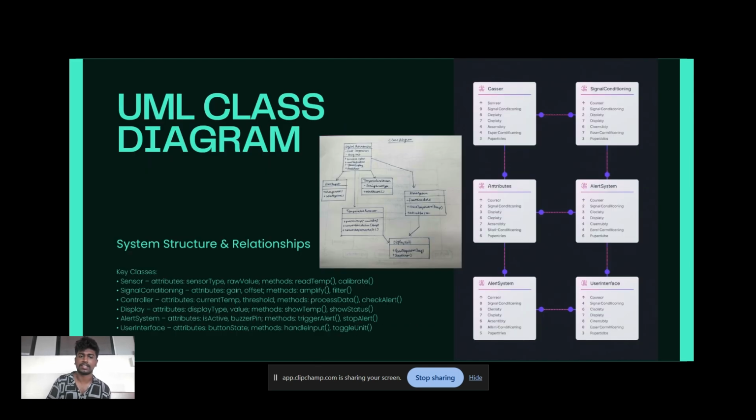Next, class diagram. It shows the overall software structure of the digital thermometer. There is the sensor class, and the signal conditioning class, which processes the raw signals and removes noise. Next, the controller class, which also acts as the main decision-making class. Then the display class, which handles showing the readings. Then the alert system is also present. So all these classes are present: alert system, user interface, signal processing, sensor classes.